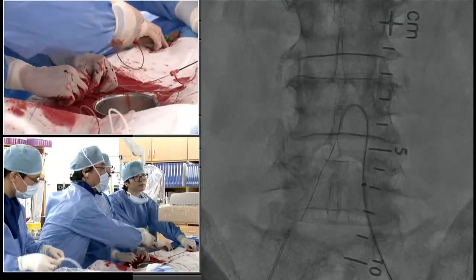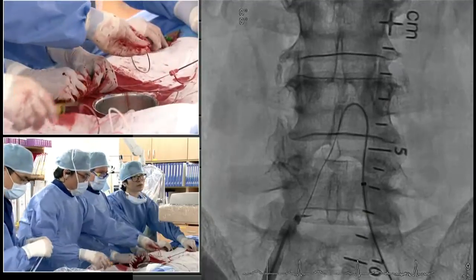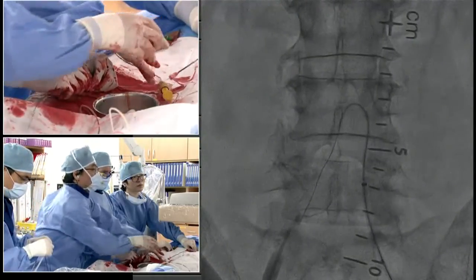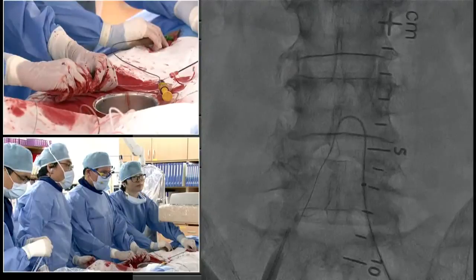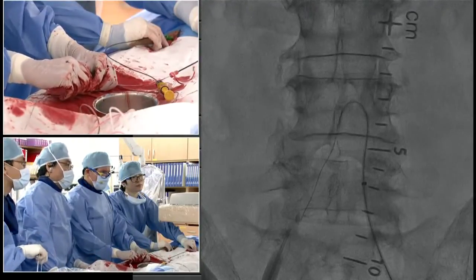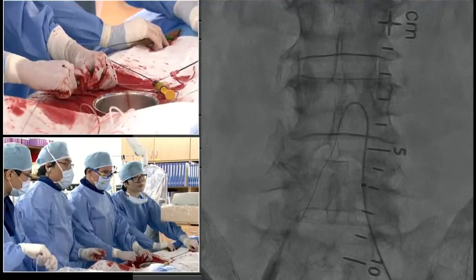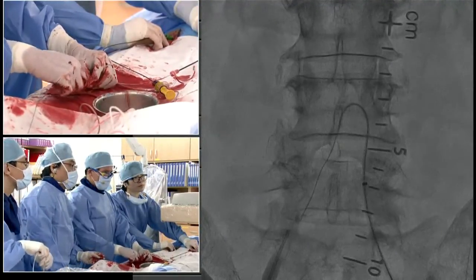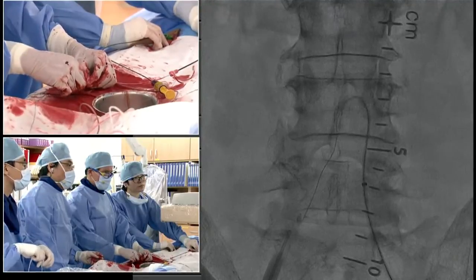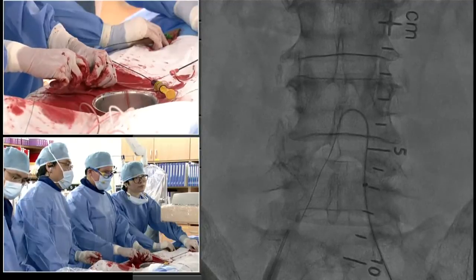Yeah, see what you want to put on Cine here? Yeah, Cine. Okay, we're pretty close. It looks like you're very, very close here. Yeah, I agree. So it looks like subintimal probably, but an opportunity to pop back into the true lumen right there.